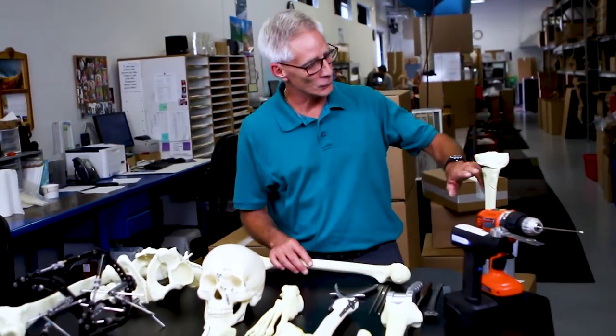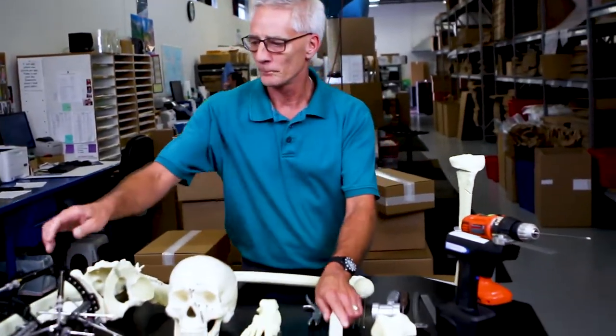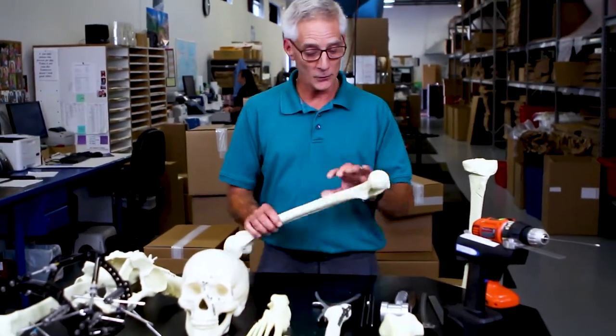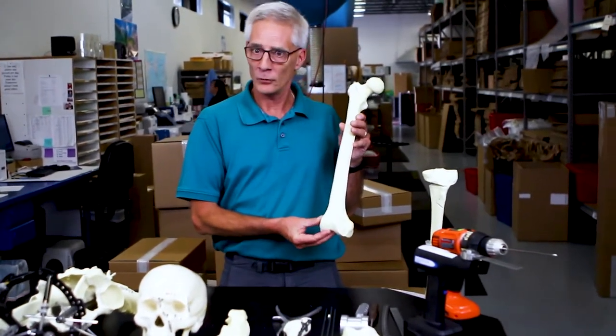Some of the skills include osteotomies, plates and screws, and external fixation. These basic procedures are still practiced all the time today, and this product remains one of our most popular products that we offer in the Sawbones line.